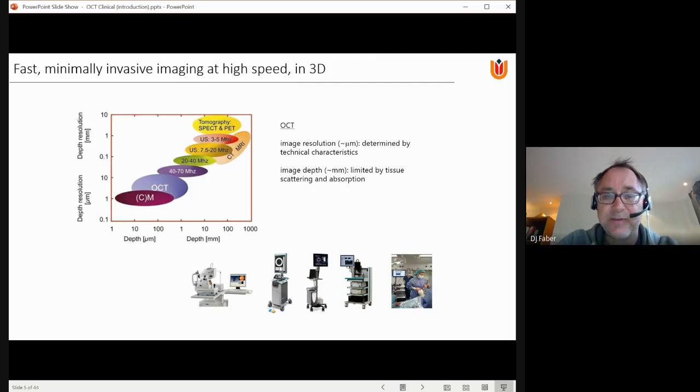So that has this headrest where the patient can put the head in and then have the retina imaged. The one next to that is for imaging the esophagus, the slokdarm. The one next to that is for imaging the aorta, so blood vessels. The one next to that is a kind of an experimental system that cannot be used directly in the clinic. We have to take some precautions, and that is then basically the photo that you see on the most right-hand side, where that system is packed into plastic and where still some imaging can occur.